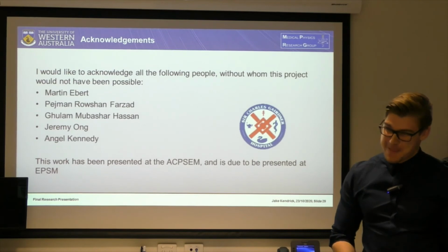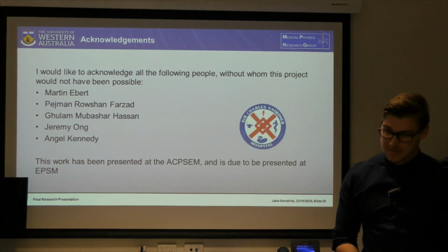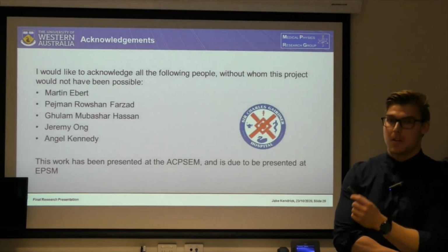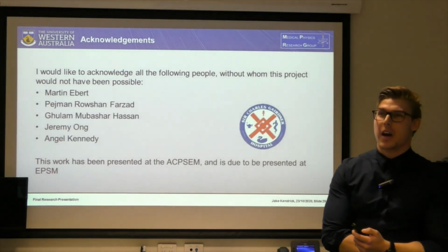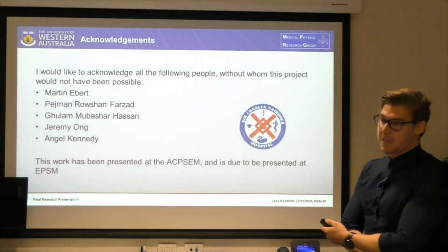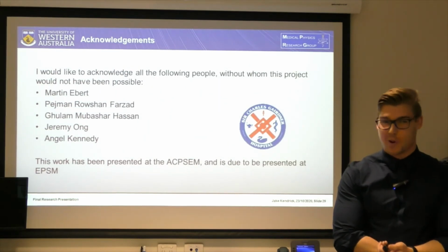But yeah. I'm sort of interested in the effect of the HU windowing, so I don't really understand it. Maybe we can talk about that later. Yeah. And there's lots of parameters you could vary there, but I wonder if scaling the HU and the PET SUV might also have an effect, like if you scale it logarithmically, for example, or did some sort of histogram equalization. Yeah, possibly. I think with a lot of these things, it's really just about experimentation because you can never really know in advance whether it's going to work.